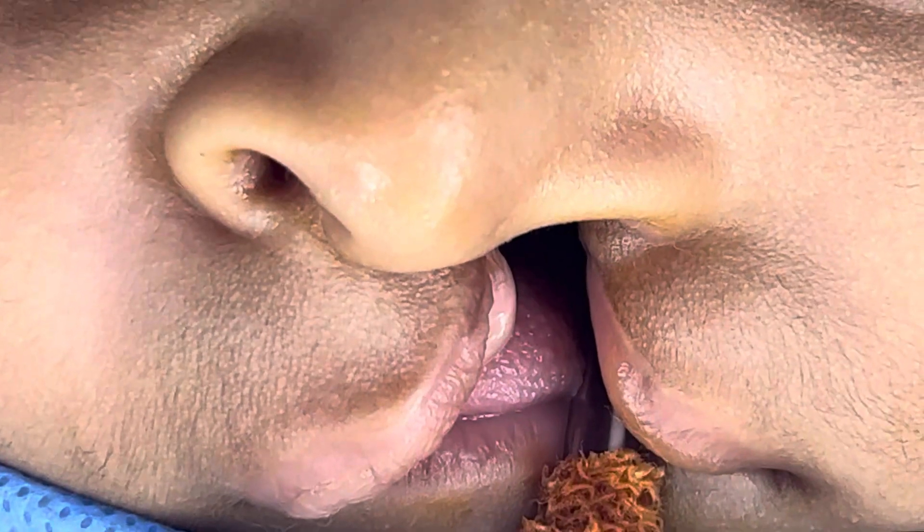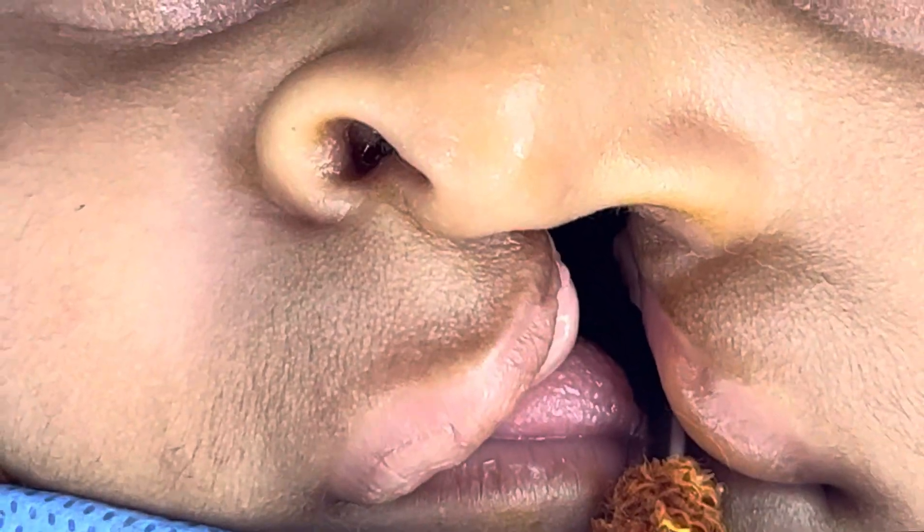We're about to start this left-sided cleft lip repair. It's going to be a variation of the Millard technique.